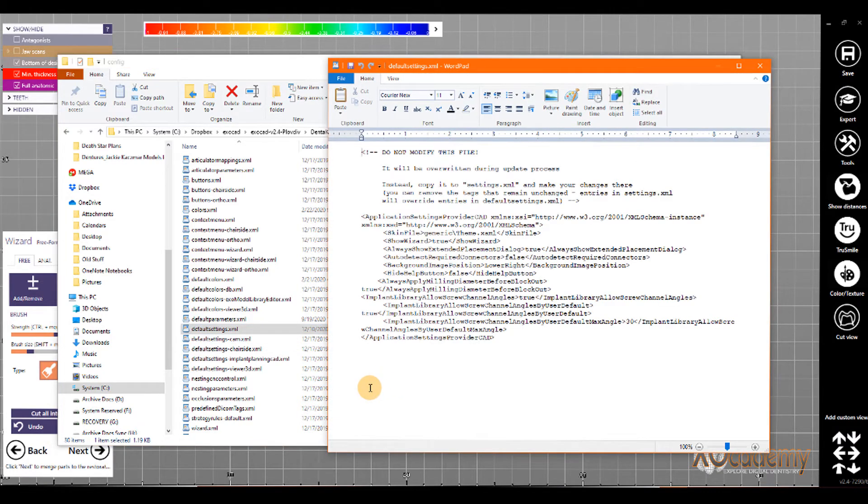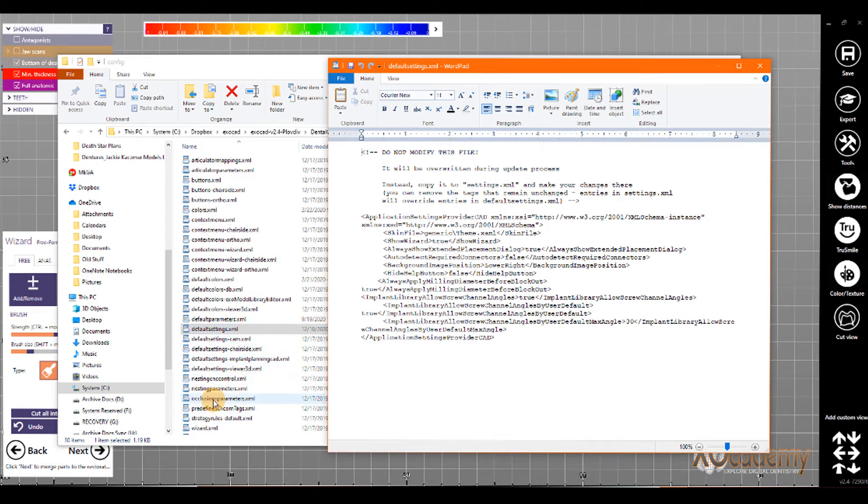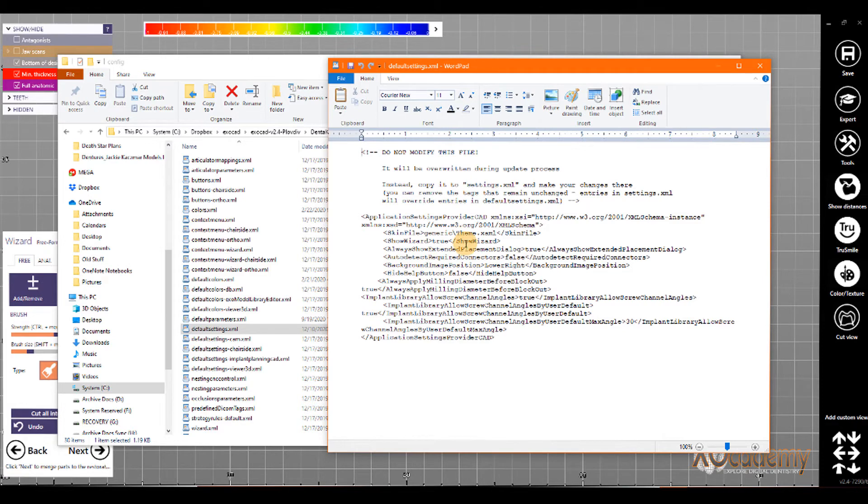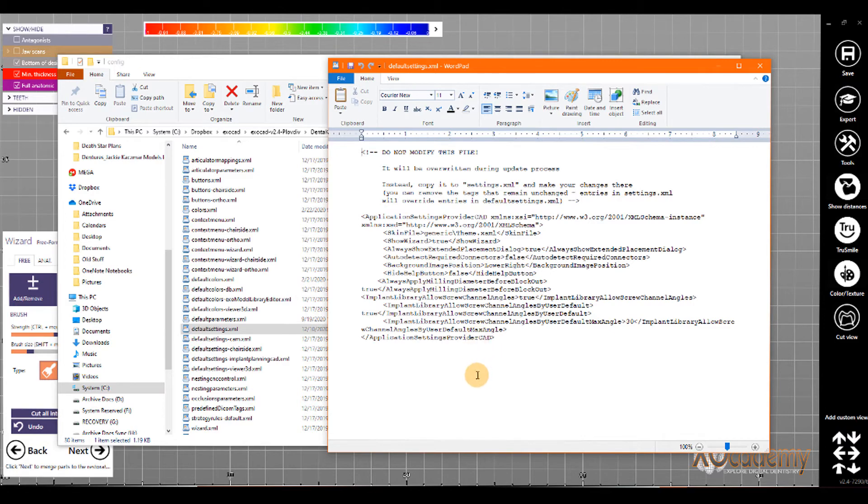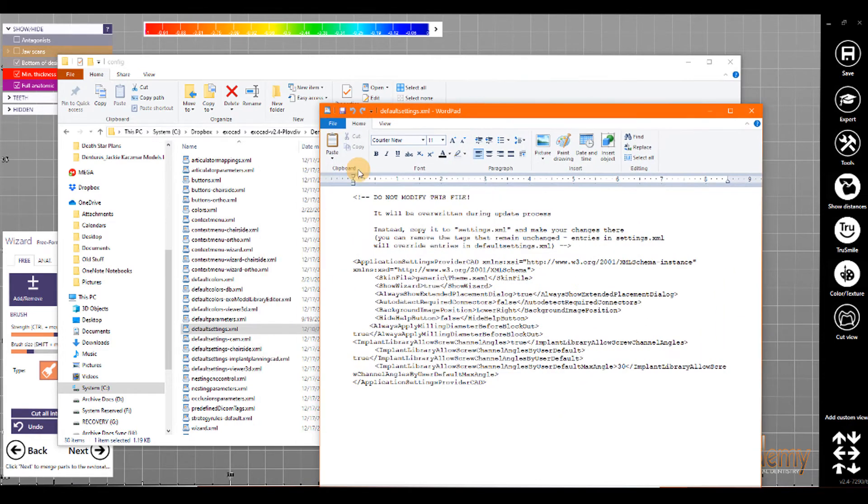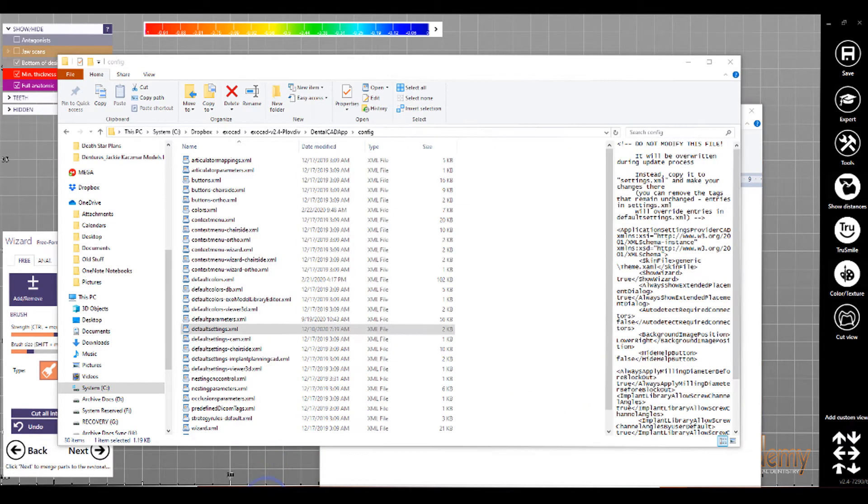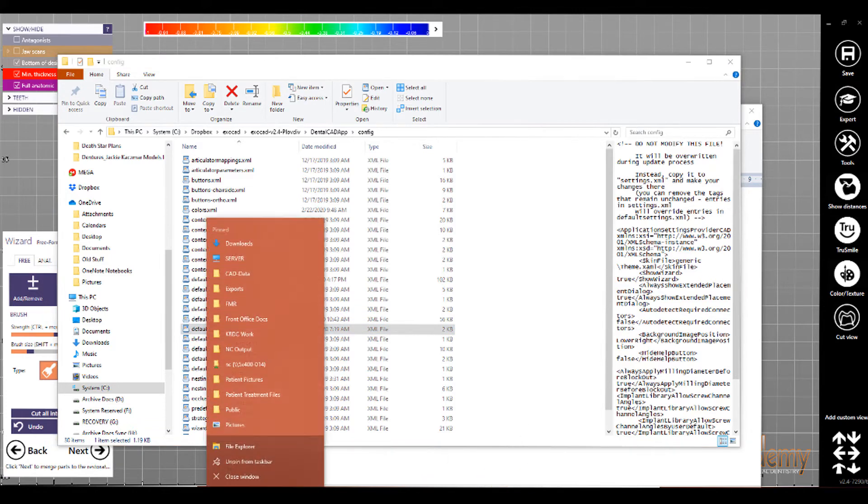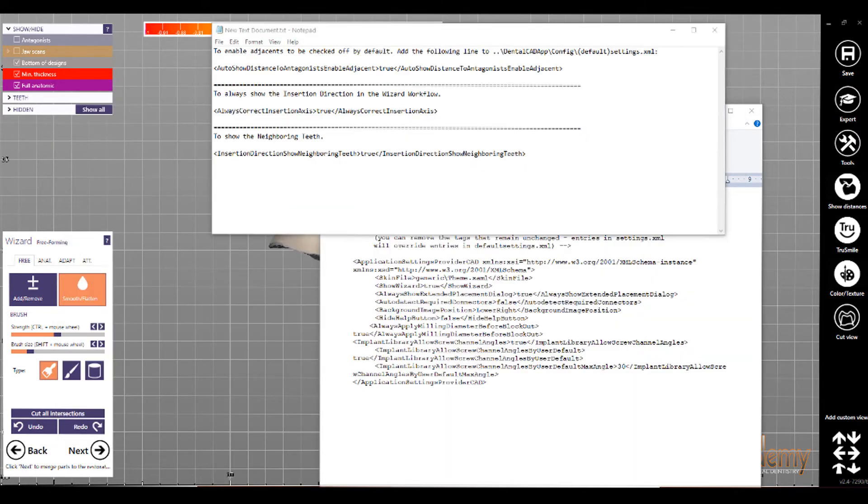Config, and the XML file that we're going to be changing is default settings. I believe it's default settings. Yes, default settings. And if you've got a settings.xml file, that's the one that you would be editing. You can read this warning here, to copy to the settings that XML file and make the changes there because any time, the default settings is kind of your backup. So, we're in DentalCAD app. And the code that we're going to add, I gotta go find that. So, here are the XML tags that we're going to add.